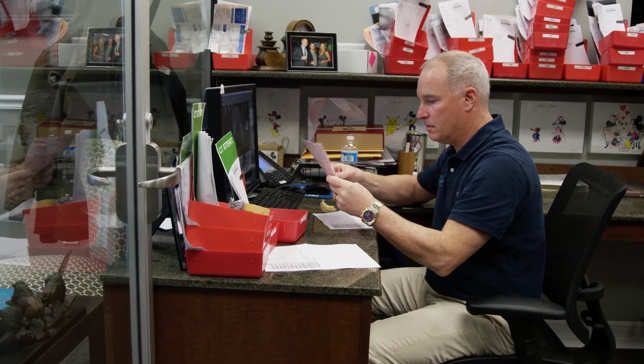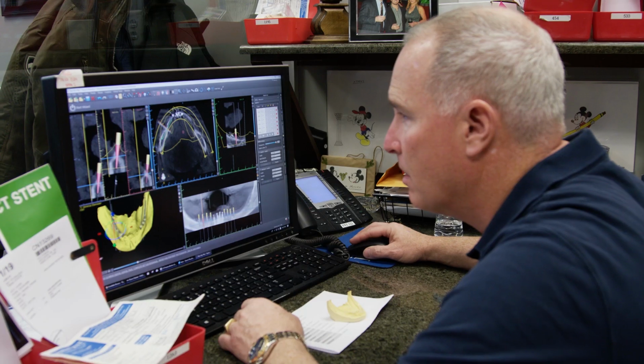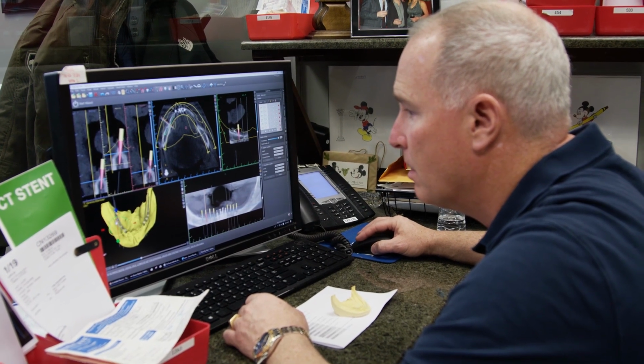And when we talk about planning the case properly, we're going to take our time, either myself or Dr. Powers. We'll spend ample time planning out your case to make sure we plan the position of those implants in the available bone that you have so that we put as many implants as we possibly can in the available bone, angle them properly to avoid the sinus cavity, avoid the nerve canals, avoid the adjacent teeth, so that we can place the implants in the placement positions that we want to use, ideally, to finish the case properly.